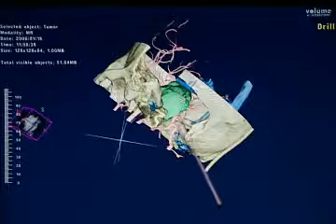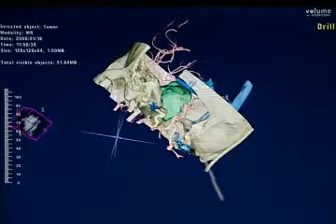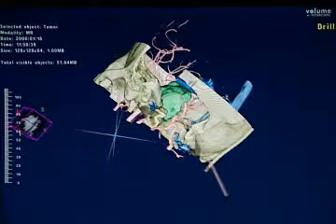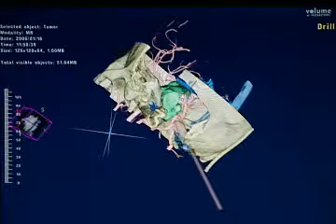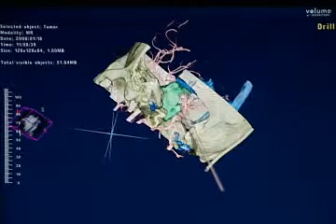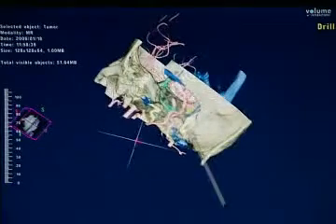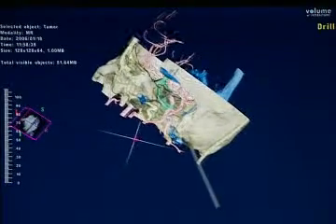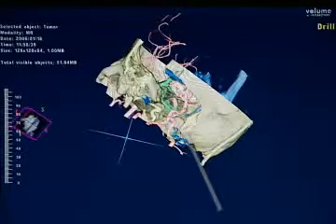Again, when you're removing the tumor, what is useful is appreciating the anatomical displacement of the vessels, which you are likely to encounter. And from that approach, you can attempt to see whether this is a good approach to remove the tumor. You can move to a slightly different angle, which is what you will see in a microscope from a coaxial beam perspective.